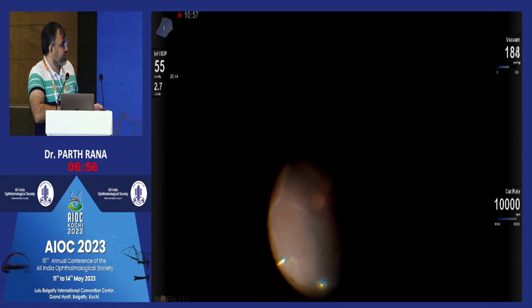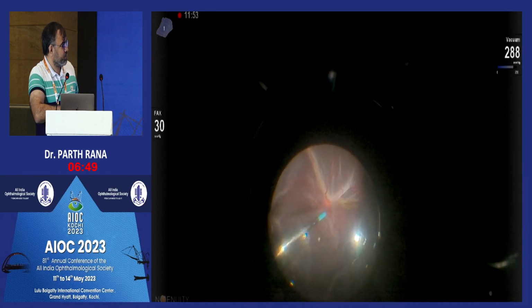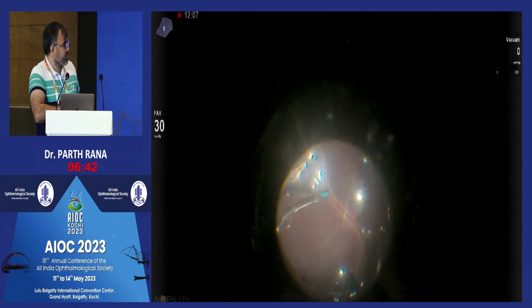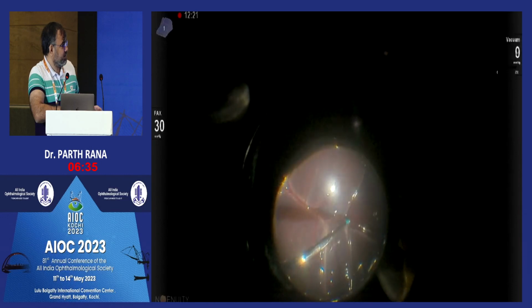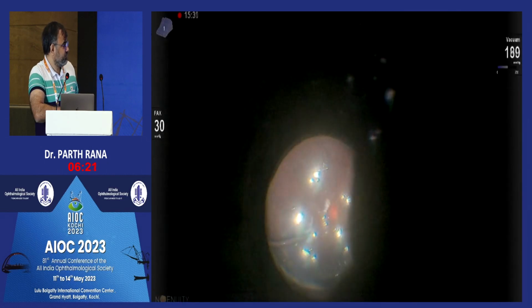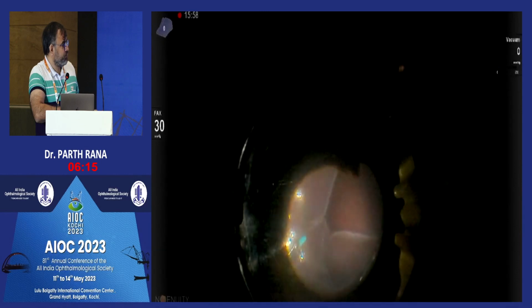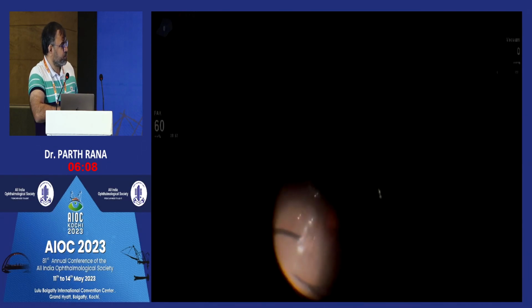So the routine vitrectomy I was doing, in some places I was able to see some choroidals, but I was not bothered about it, as it will drain out by itself later on. So air fluid exchange was done. Here, as we can see, one choroidal was there. I did retinotomy. I removed the subretinal fluid. Once the retina was settled, I felt the surgery is almost over. There won't be much of the issues. As we can see, one choroidal detachment was left, and I was not touching it because it was quite posterior.